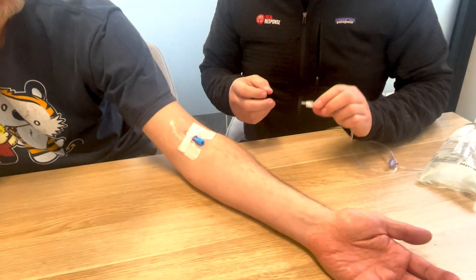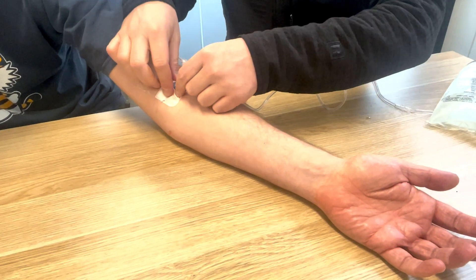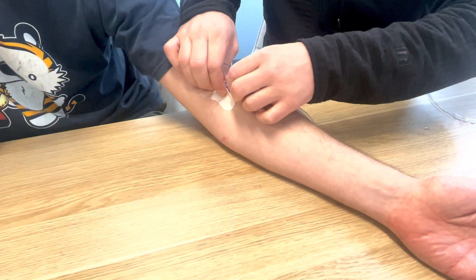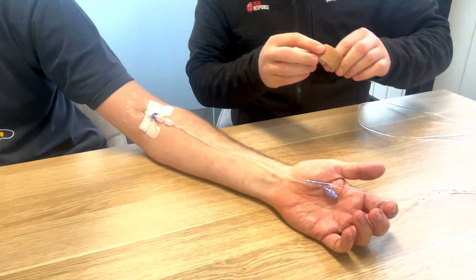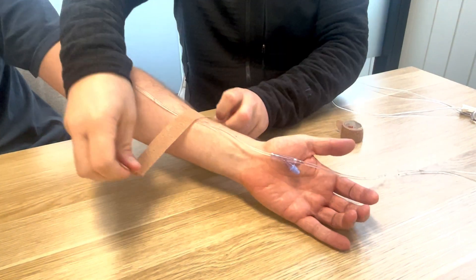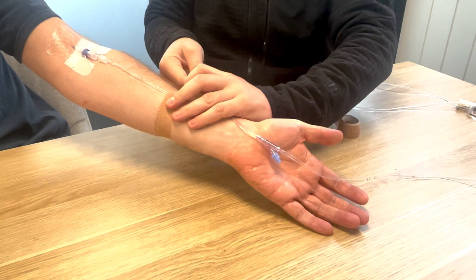So what I want to do to ensure that this line doesn't actually pull the cannula out, is first you're going to start by catching this on. Take this down along the forearm, take one piece of Coban or tape — lift your arm up for me — don't need to go too crazy, one piece over here.